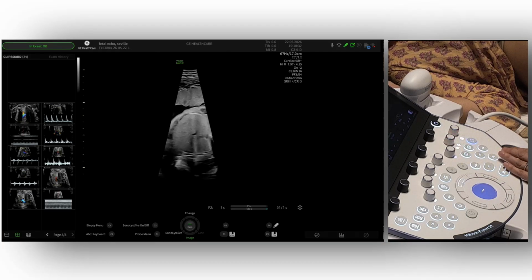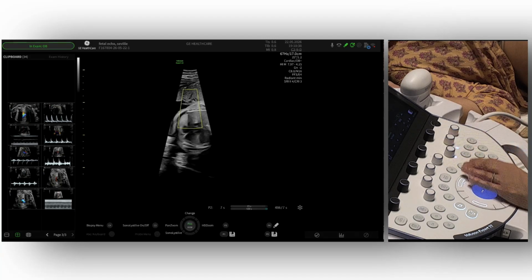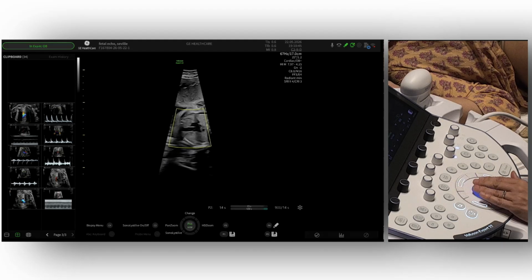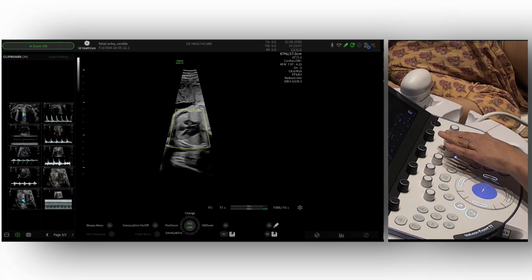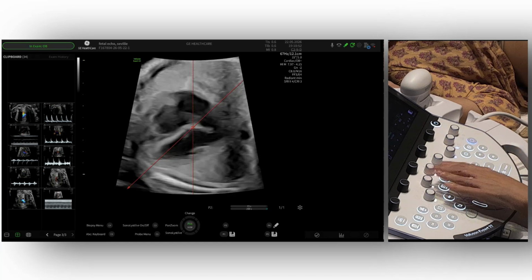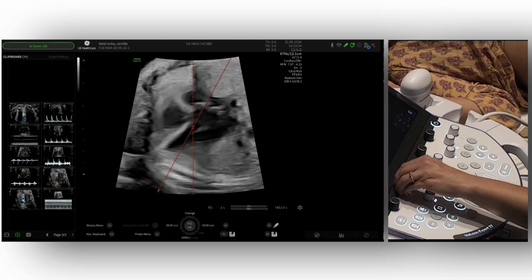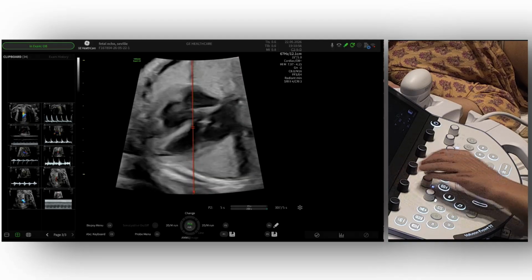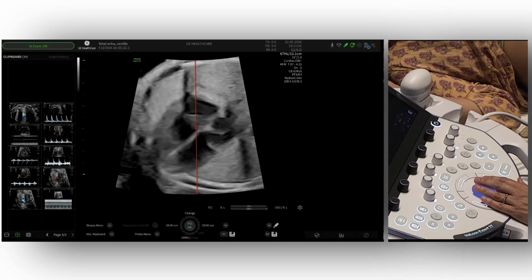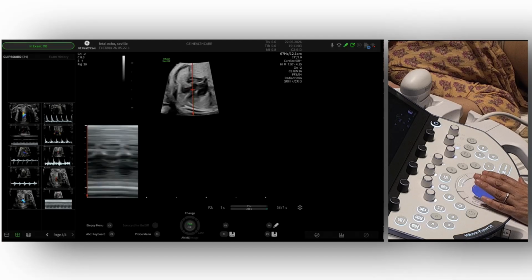Another way to look at that is the one that I love most, because I find it very useful. It's M mode. For M mode, we first do the zoom. I know that people do not like M mode very much, or find it scary, but when you get used to working with it, it's very helpful and very nice. For this, we need an oblique view, like here. Not a transverse, not an apical, but an oblique view.